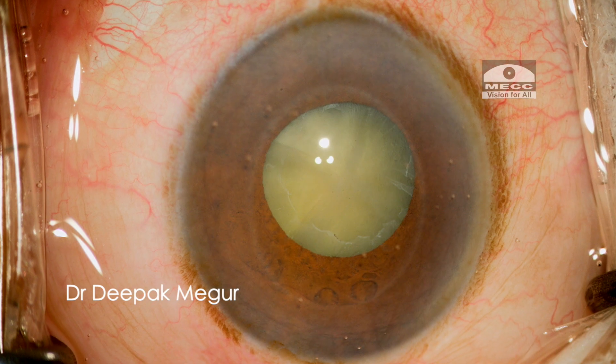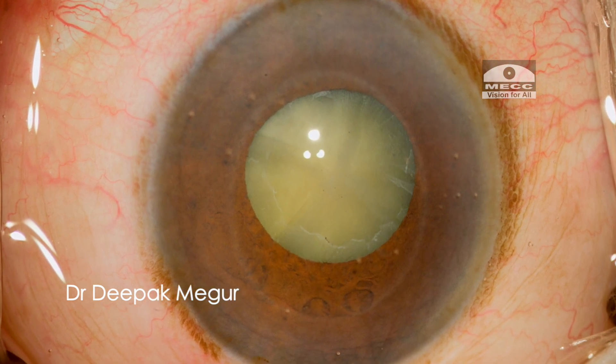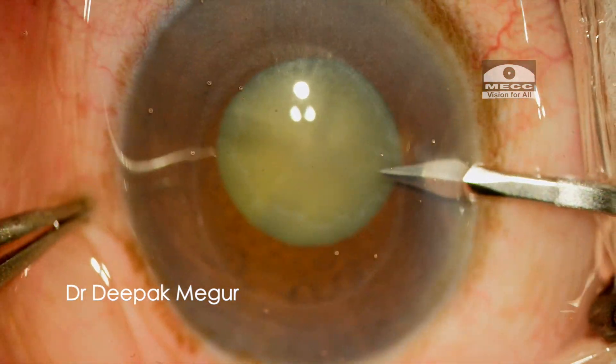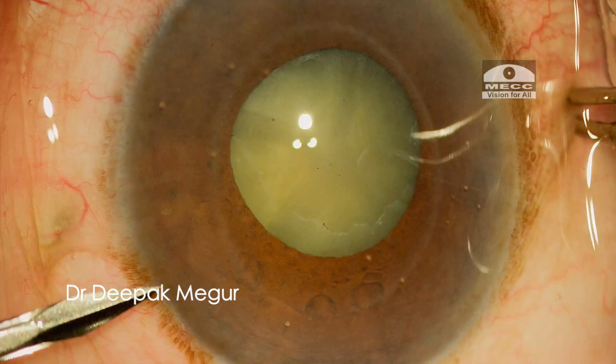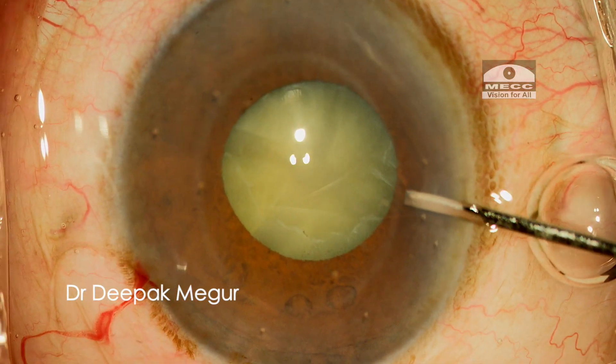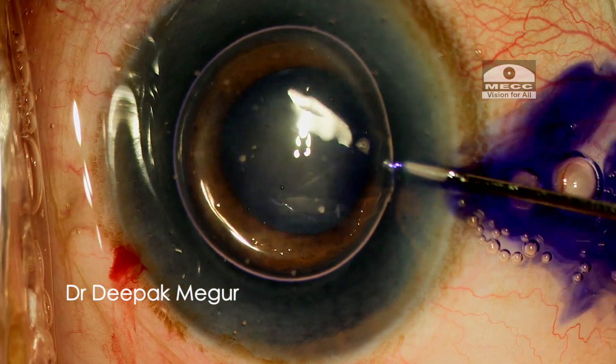Today we are back with another case of a non-dilating pupil. This elderly patient has pseudo-exfoliation and this is the maximum pharmacological dilatation that could be achieved. I also need to be aware of the possibility of lax zonules in this case.